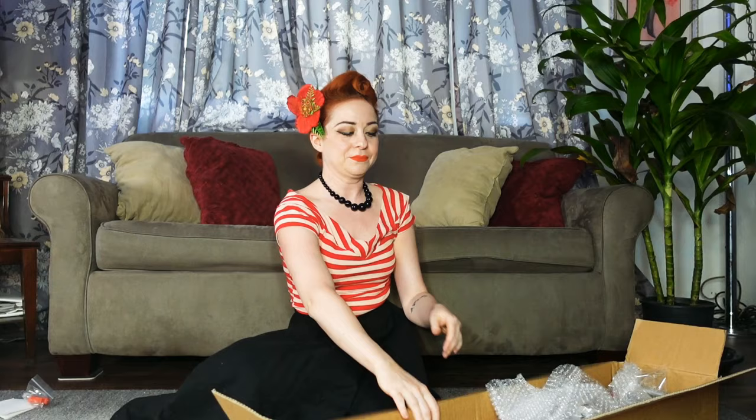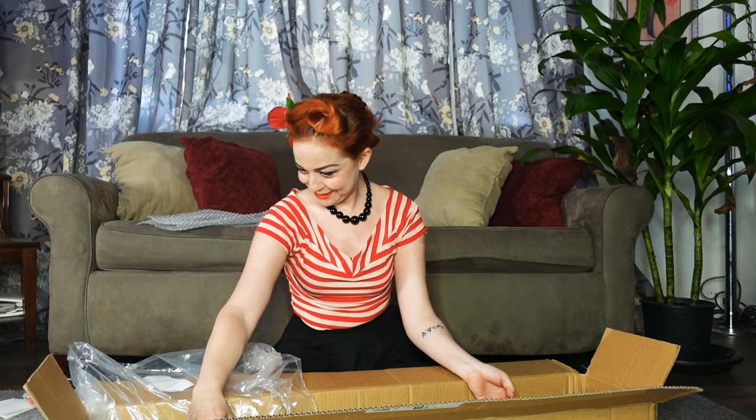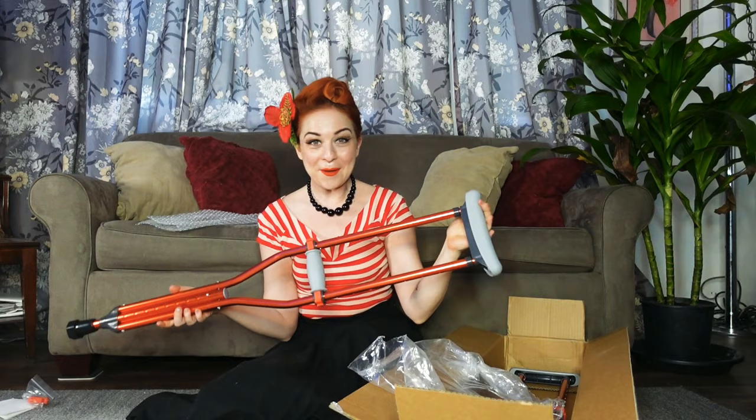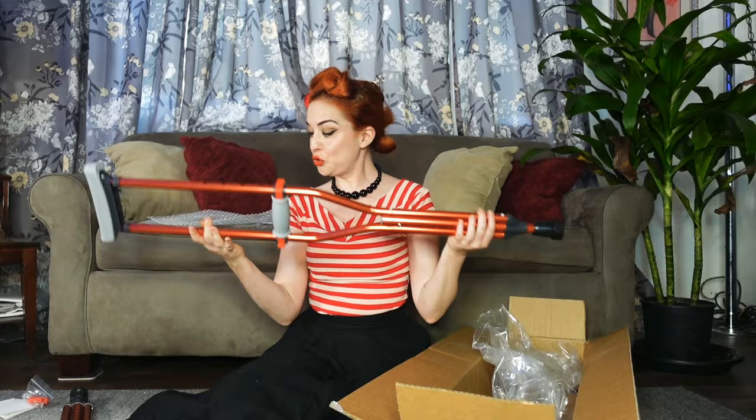Looks like I wore the right outfit for these today! It's warm in here — I turned off the AC. Got a little extra pair of clippies. Are you ready for the big reveal? Oh, are they so pretty! Oh my goodness — and they're sturdy. Very different crutch tip; I'm not sure if I'm going to keep these, we'll see how they are. But gorgeous color, gorgeous color!